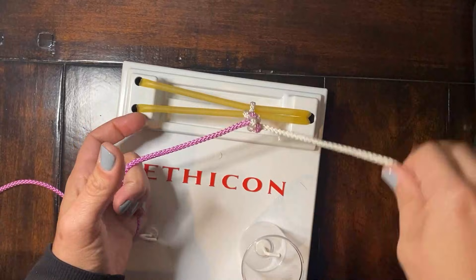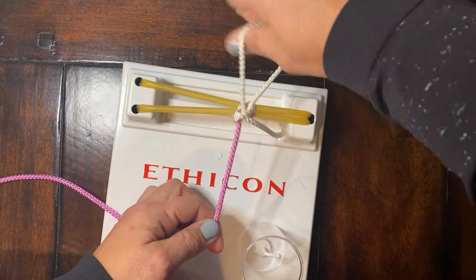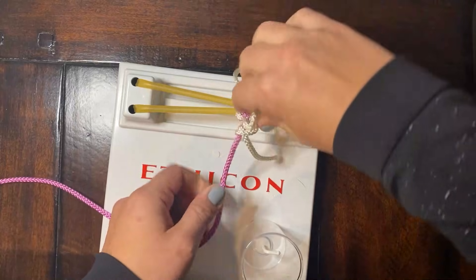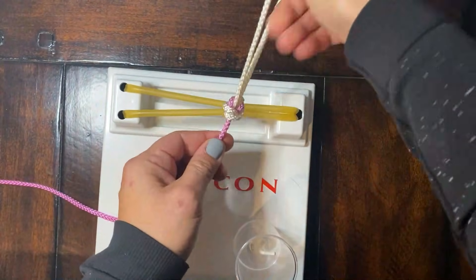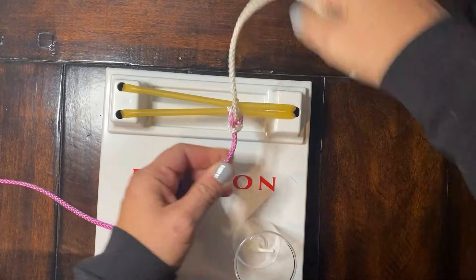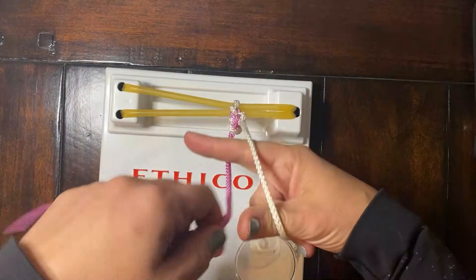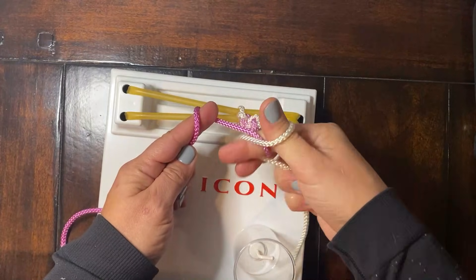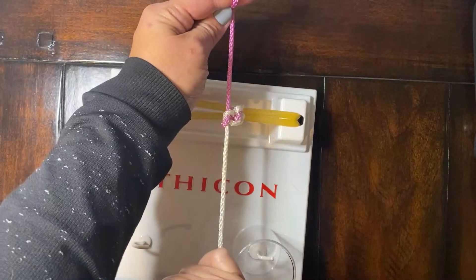So one more time: pinch and chop, wrap, middle finger, which pulls — it's a nice tight knot — away. Second time, J, which comes under, wrap, index finger, comes towards you.